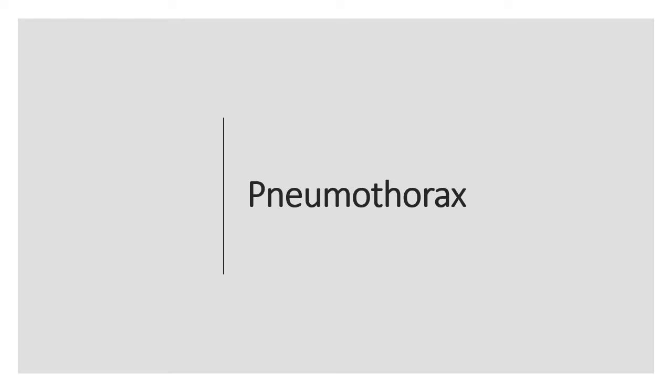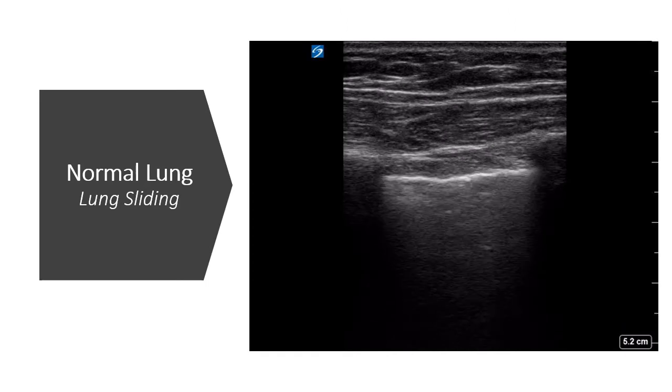All right, so let's move on to pneumothorax. This is definitely one of the most useful ways that ultrasound can be used. It can be done very quickly in a patient that is decompensating to identify a possible pneumothorax and the need for needle decompression. Again, there are several important things we need to point out.